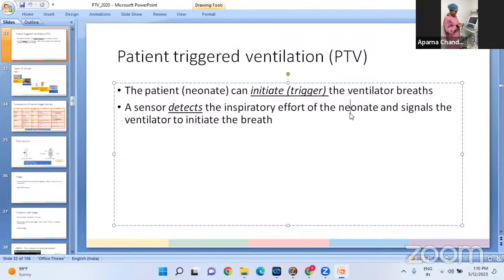So coming to the parts of the circuit, we know that this is the first part of the inspiratory circuit, which goes to the heater humidifier circuit. This is a servo controlled heater humidifier mechanism here. So you can see that this is the heater humidifier chamber, and this is the heater base. So when typically it is on, this plate will be very hot. And with the metal conducting surface, the humidifier chamber is placed. This needs to be filled with water until the black line, which is indicated here.